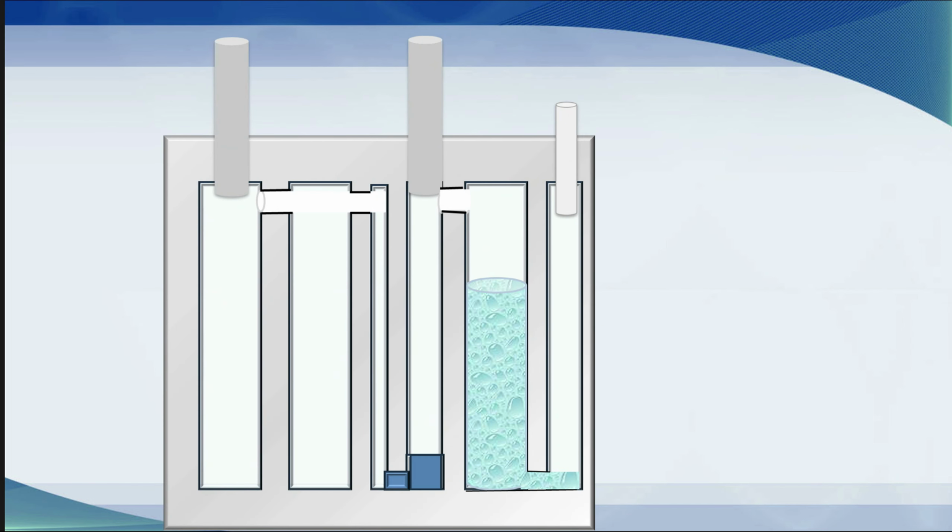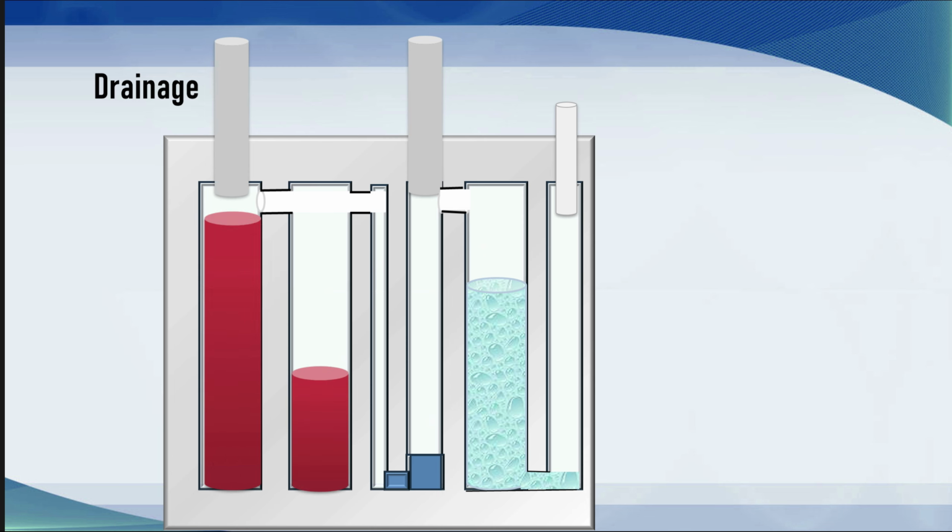Let's review how the 3-bottle system works in one product. The first component is passive drainage of blood, serous fluid, or air. Blood drains into the first canister and then into the overflow. This will hold up to 2.5 litres if a single system is used. Air bypasses this and travels to the underwater seal compartment.